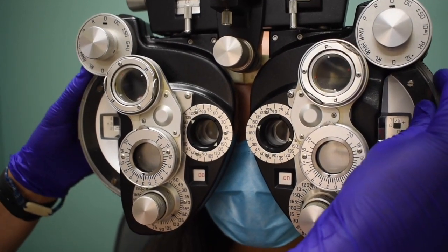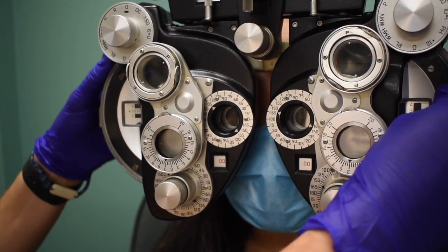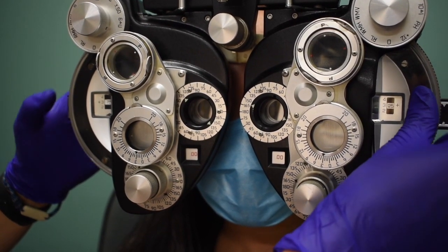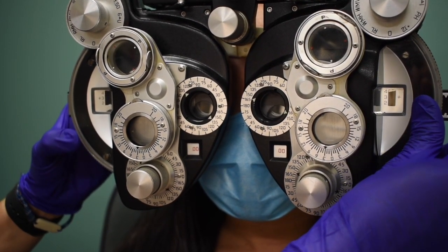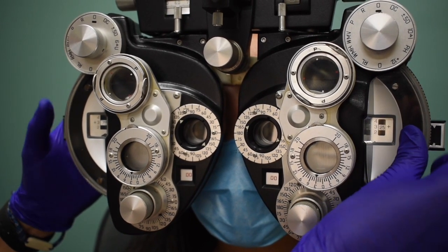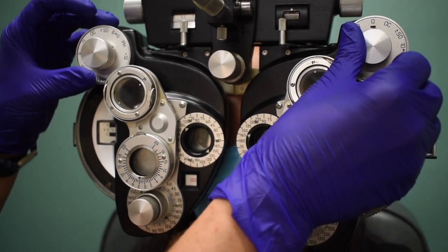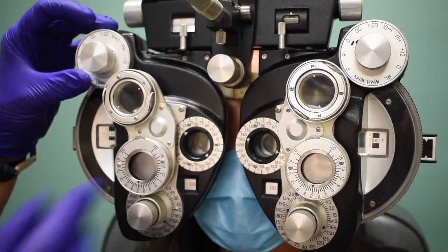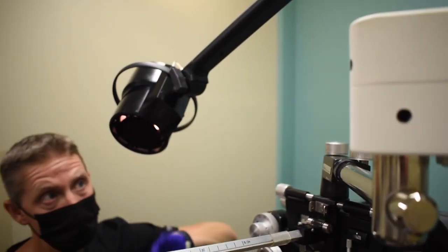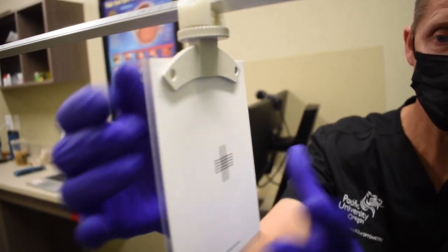Just let me know when you couldn't read any of those at all, Phoebe. Right here? Good. I'm going to go 2 past. Tell me when you could read a couple. Right here. Great. So now we've blurred her out and recovered. I'm going to put the plus minus 50 cross cylinder lenses in place. I'm going to rotate the light to up and behind, and rotate the cross cylinder around for her.